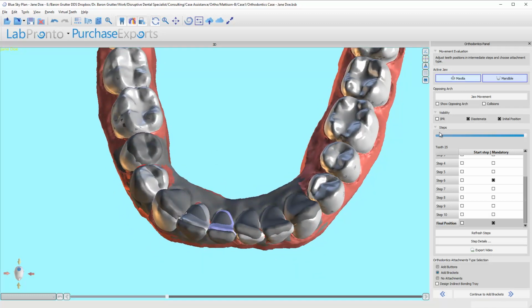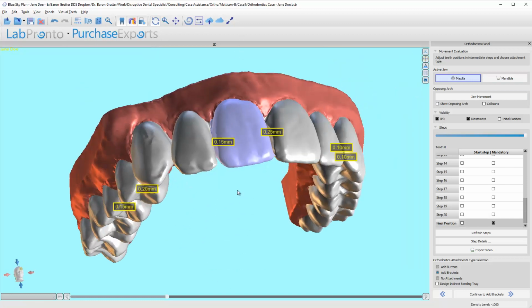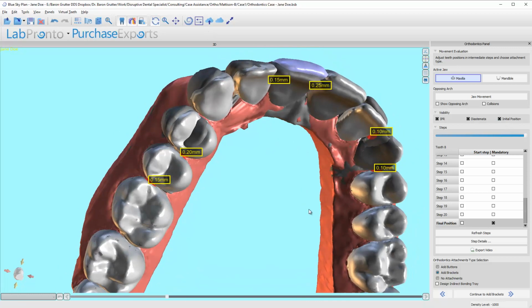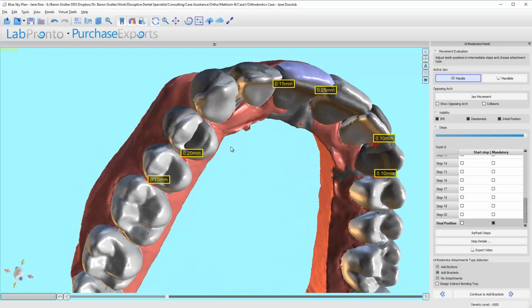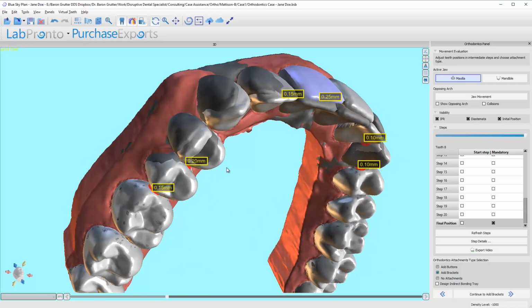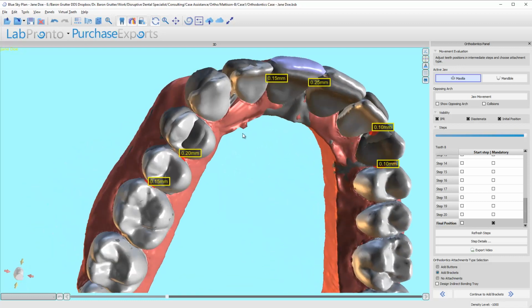I did forget one thing. Let's go up here for a second. We rotated this premolar, as I recall. We end up, yeah. I'm not going to worry about it. Yeah, we already have a horizontal button. We had a horizontal button on. So anyway, sorry. That's it.